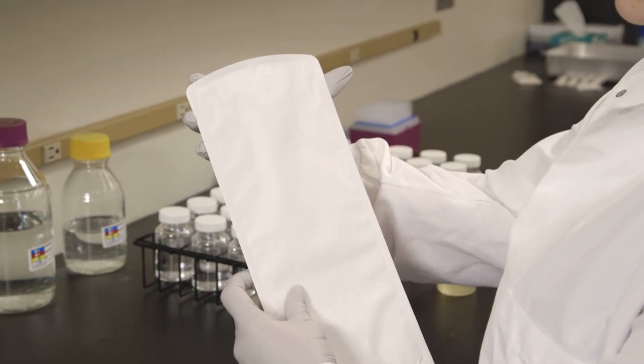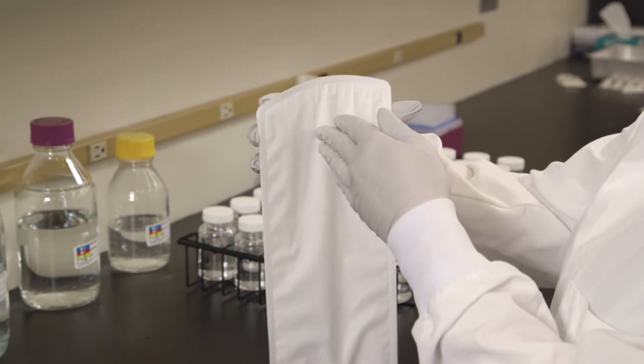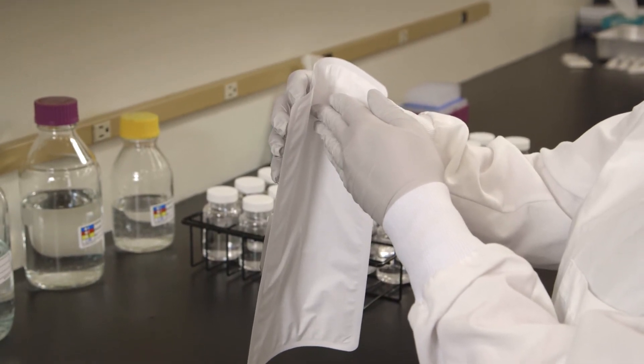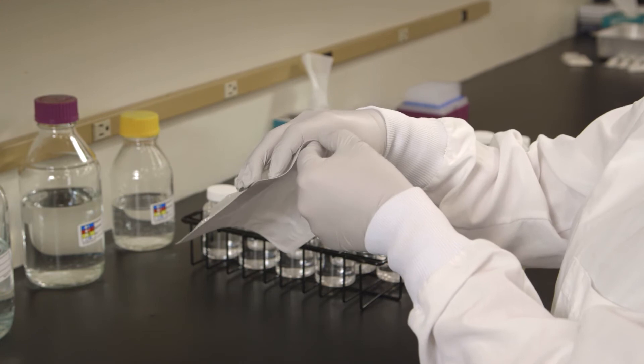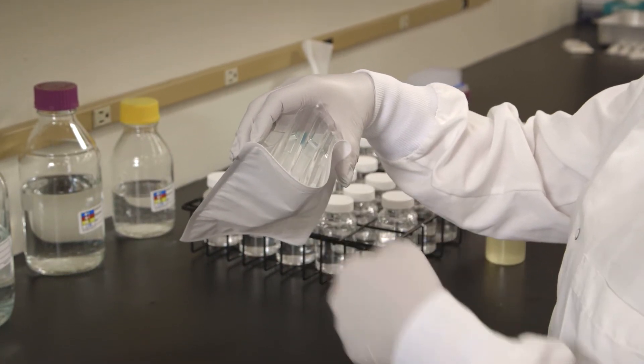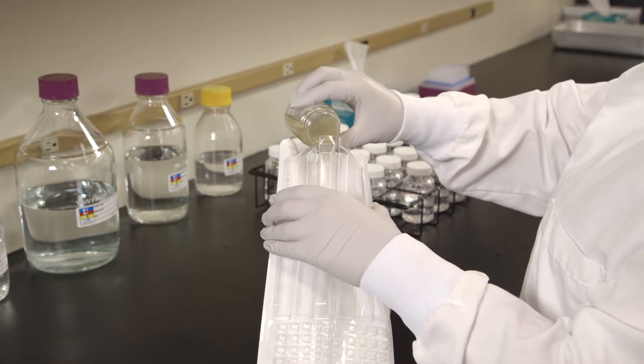Once the LegiAlert reagent has dissolved, hold the tray at the top with the well side facing your palm. Push the top edge of the tray in with your free hand while squeezing the tray into a circle. Open the tray by pulling the back away from the well side. Avoid touching the inside of the tray. Aseptically pour the sample mixture into the tray.